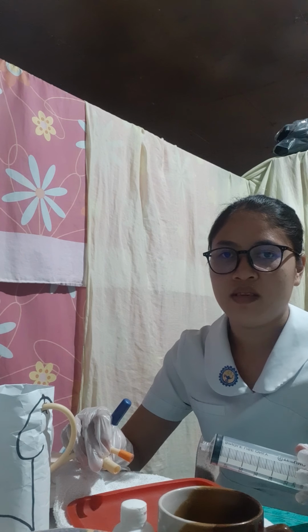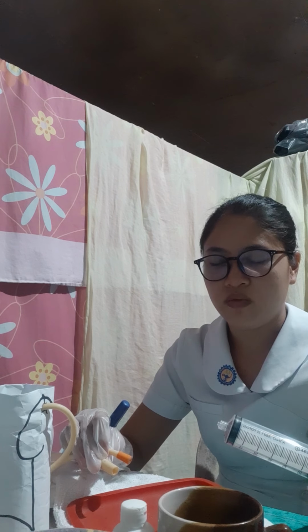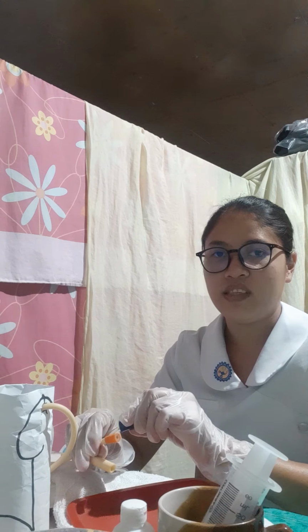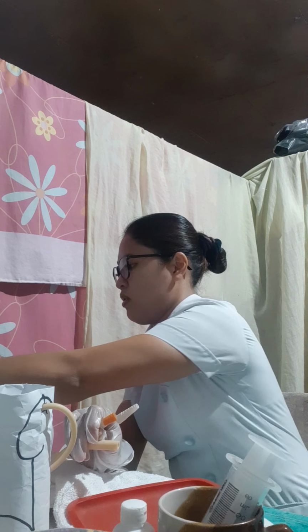And continue to irrigate the client's bladder until the total amount to be instilled has been injected, or when fluid returns are clear and clots are removed. Then next, we are going to remove the protective cap from the drainage tubing and wipe with antiseptic swab.